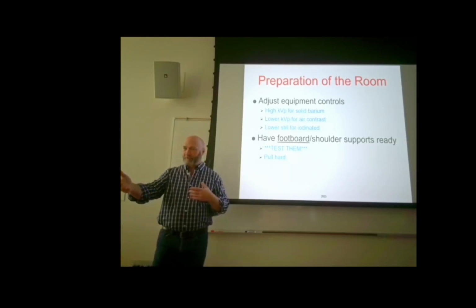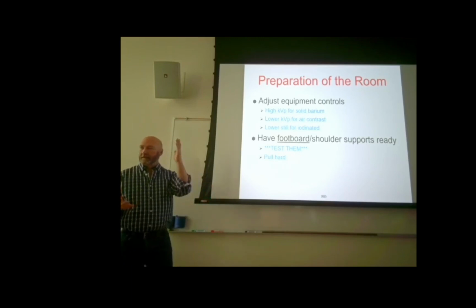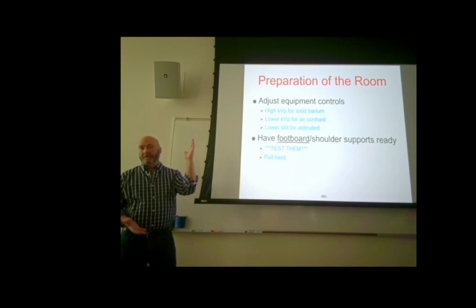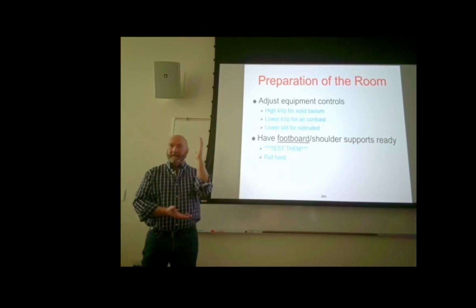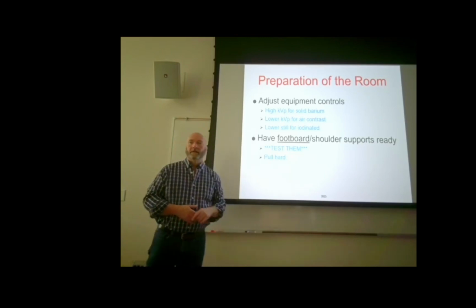Anybody ever experienced something like that? Okay, well, kind of similarly, if those tabs don't completely engage, and then you take the patient, you stand the table up, if the footboard doesn't slide off when you stand the table up, what do you think is going to happen whenever the patient steps on it? Going down. It's coming off.